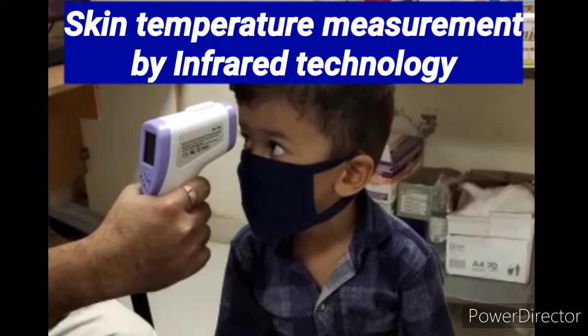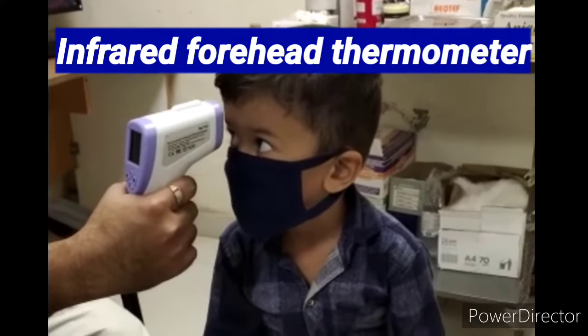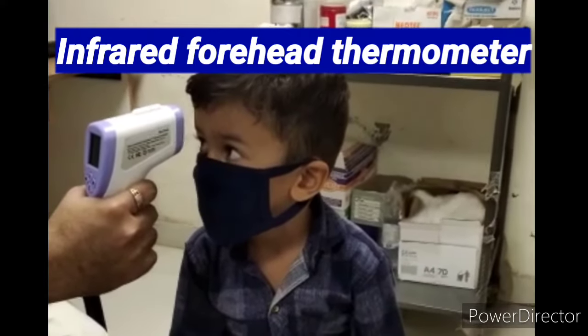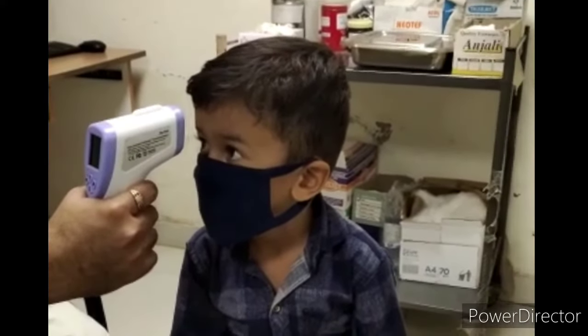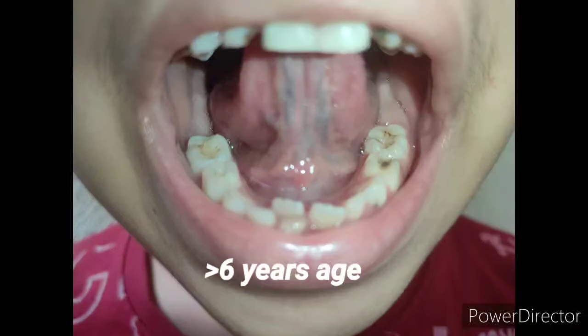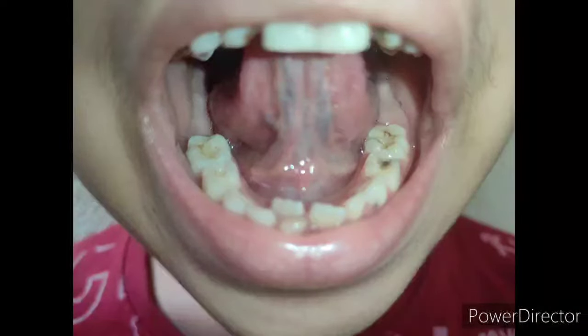I am now showing you how to measure skin temperature using infrared technology. We are all aware of this because during COVID we used this technology — it is touchless and records temperature within a few seconds. For oral temperature measurement, we put the thermometer under the tongue. It should not be used in children less than six years of age, and we keep the thermometer for two to three minutes.